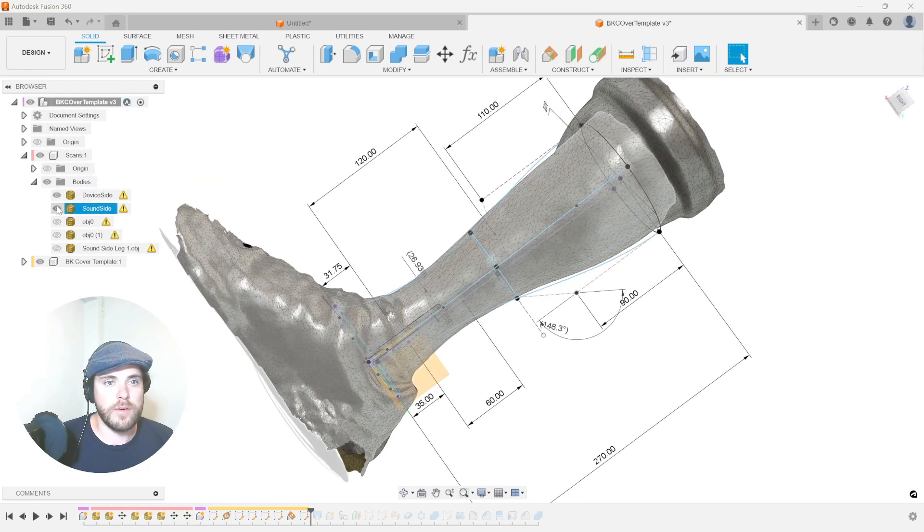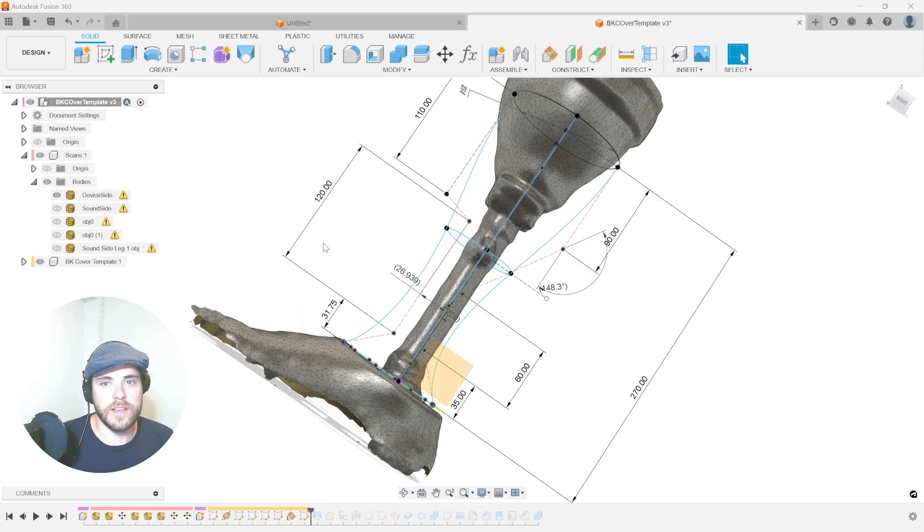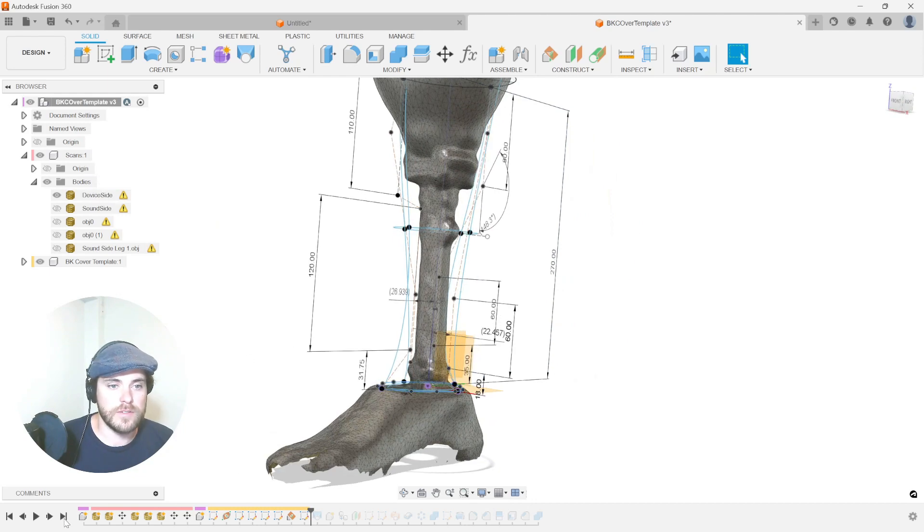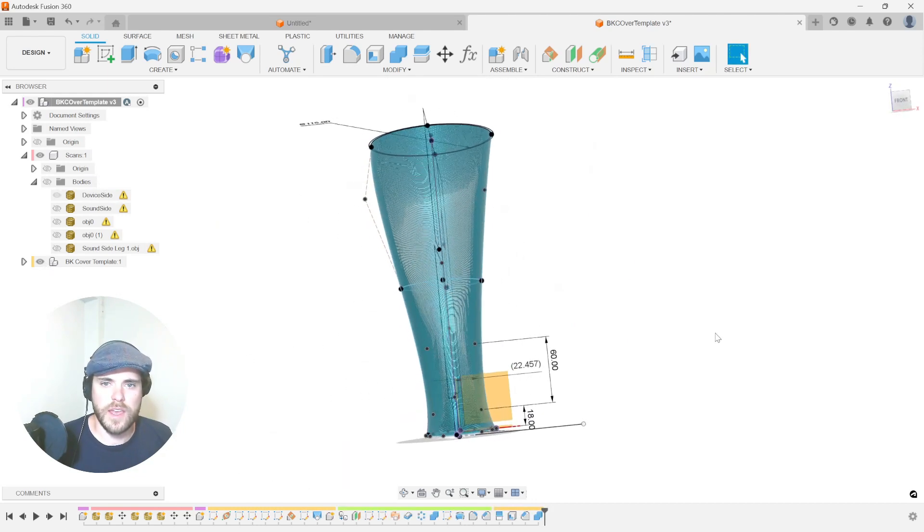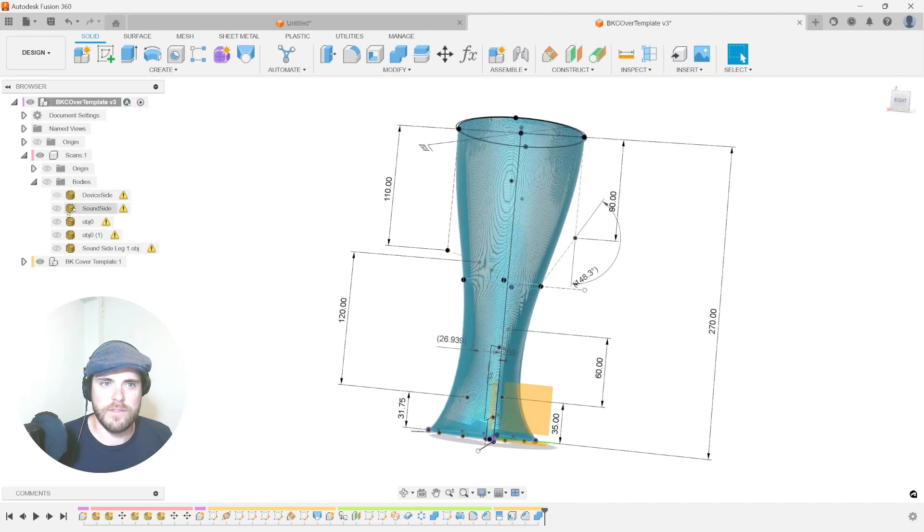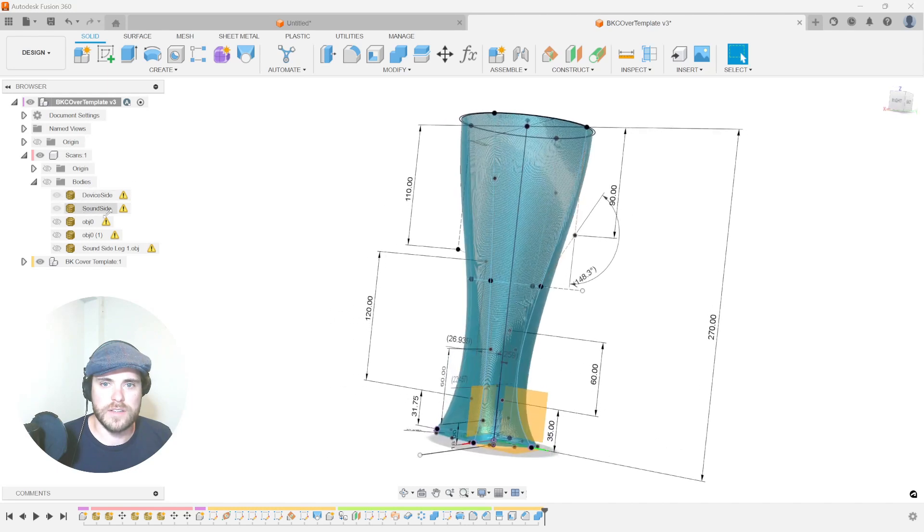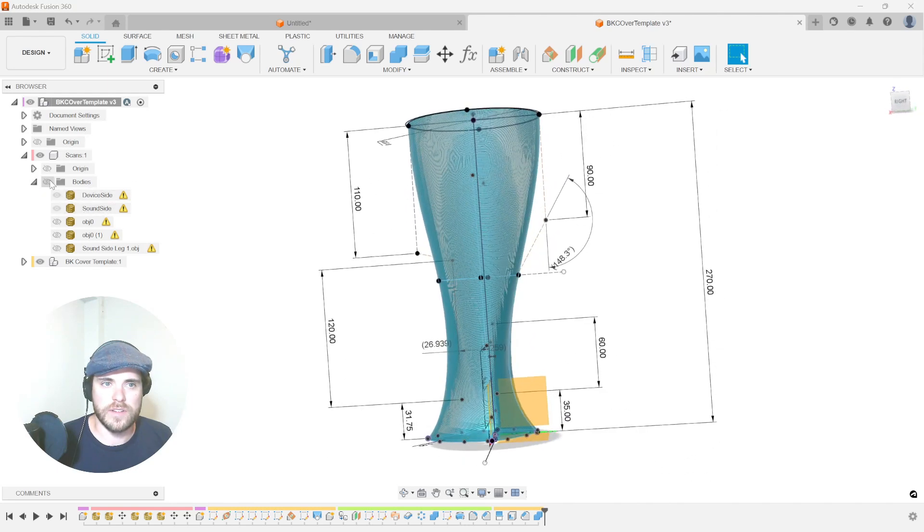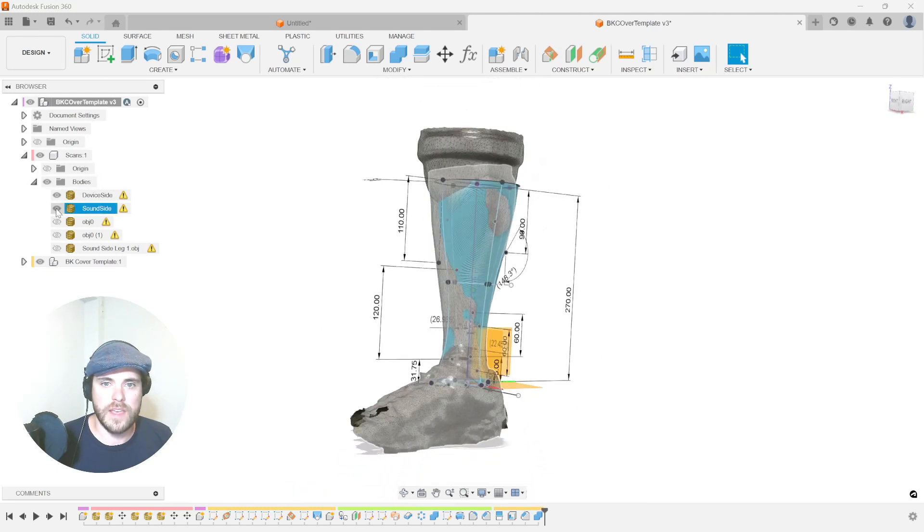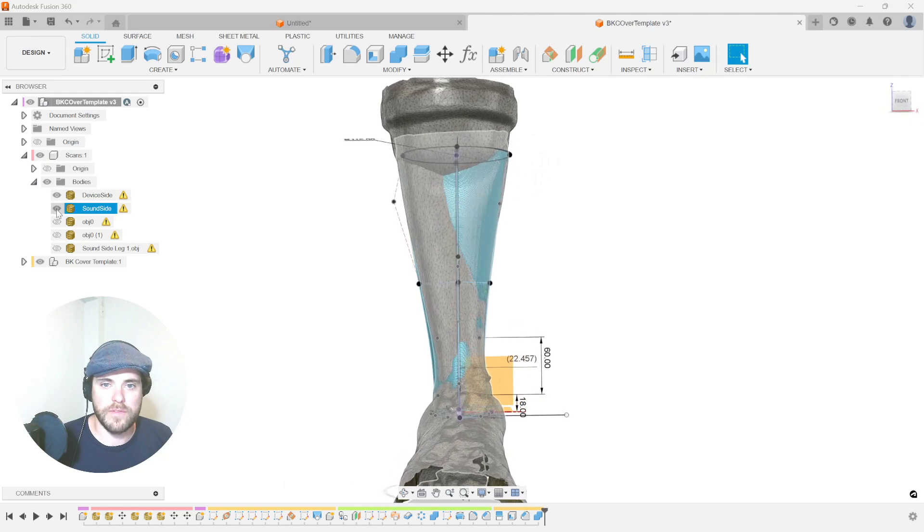We now all we have to do is just rebuild the rest of the timeline to the end. And just like that, there it is. We now have the ability to see our sound side and our device side together to see how they well fit.